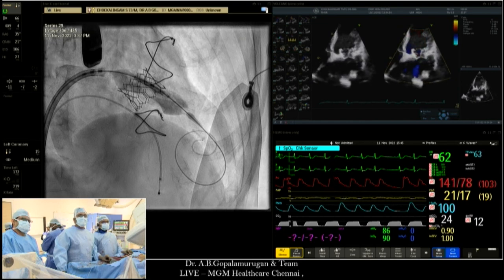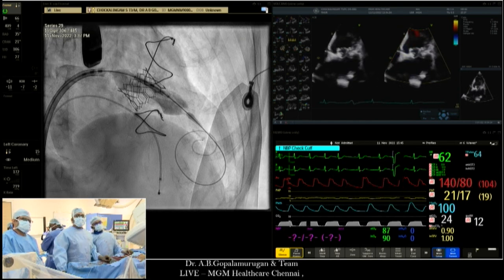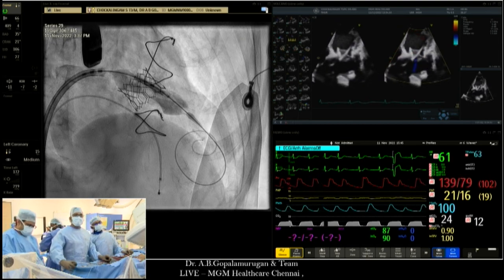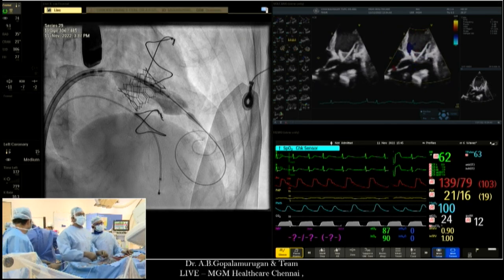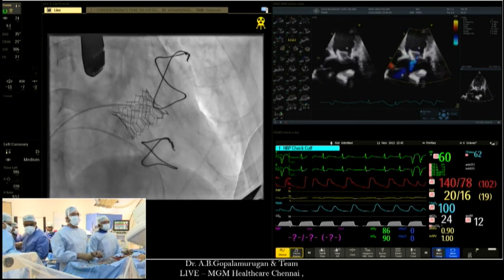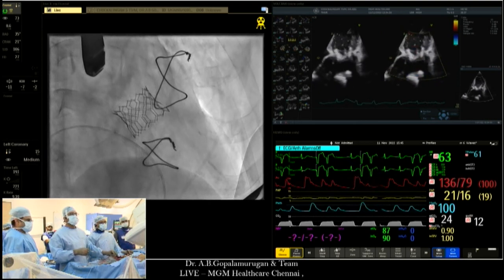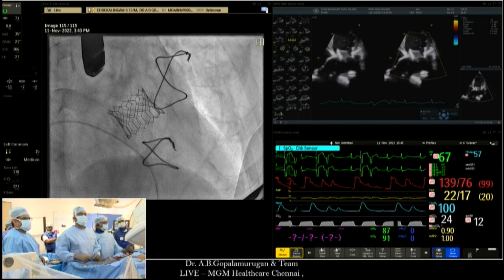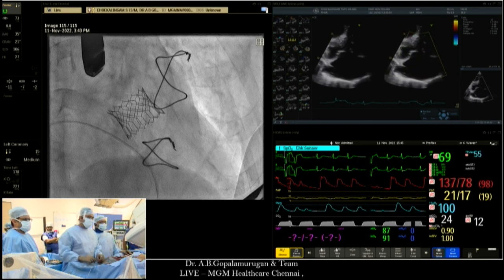You can see here, we have a laminar flow through the mitral valve. We have no mitral regurgitation, and there is no valvular or paravalvular leak. We are set to take everything off, and I am ready to jump on the plane to catch you guys there for a whiskey. Yeah, the TE shows amazingly well. Excellent. Look at that. Congratulations. The team will break for the TE. Wonderful demo of TMVR. Thank you.